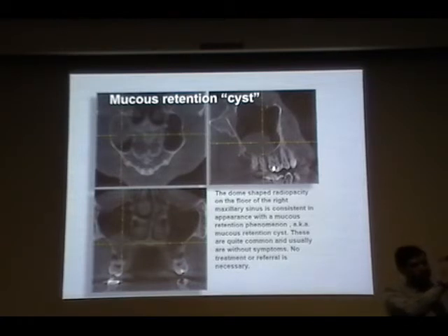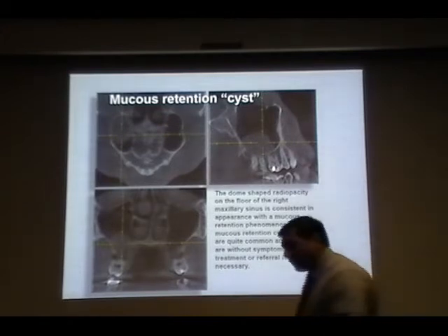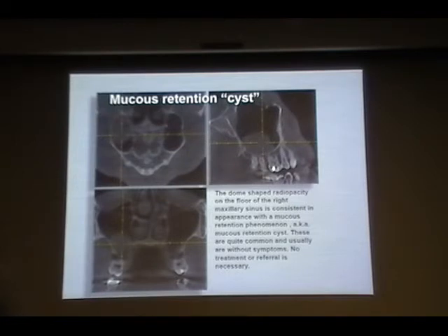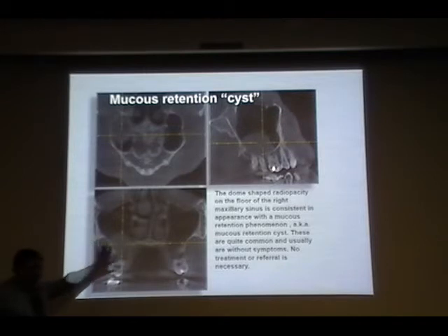It forms a dome-shaped structure. It most likely is because of allergies, and then you are going to see this kind of presentation, especially if you take a pan or a periapical radiograph during the spring. And when you take one more PA during summer, it would have gone. So it clearly tells us that it's because of the allergies. So for this, we don't treat this one.